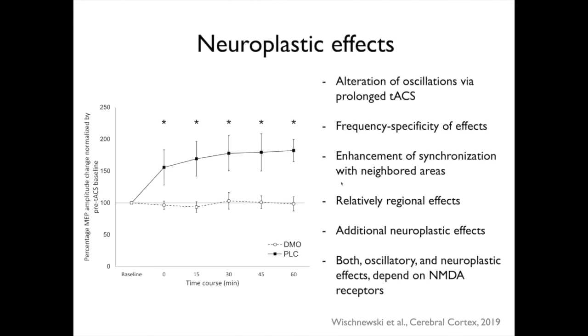We additionally did TMS afterwards, measuring motor evoked potential amplitudes over the motor cortex, and saw that we didn't only enhance oscillatory activity, but we did also enhance plasticity. So we did induce plasticity. Enhanced motor evoked potentials were also present 60 minutes after the end of stimulation. These were also dependent on NMDA receptors; blocking them abolished these effects.